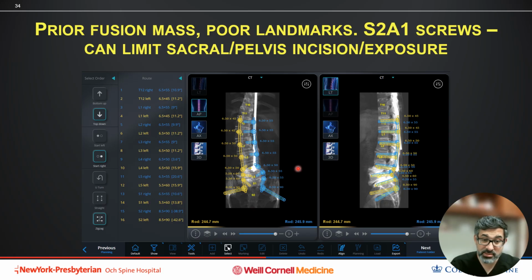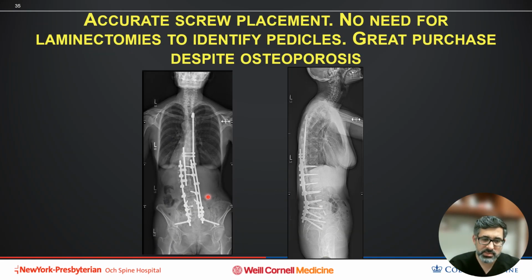The screws are planned so that they are the biggest diameter and longest screws that we can get in these patients, so specific to the patients, and also the positioning of the screws is very specific. So you can see it's important for me to know exactly how deep each screw is going to be placed, because my rod is going to be made based on that exact position. So here's a plan for the screw placement, and here's then the final execution of it post-op.